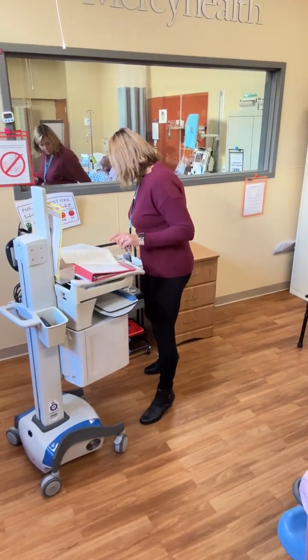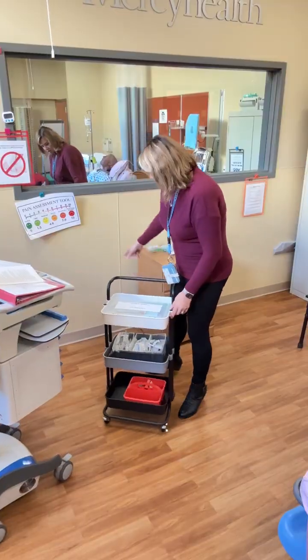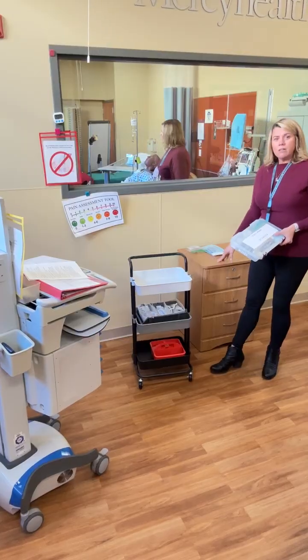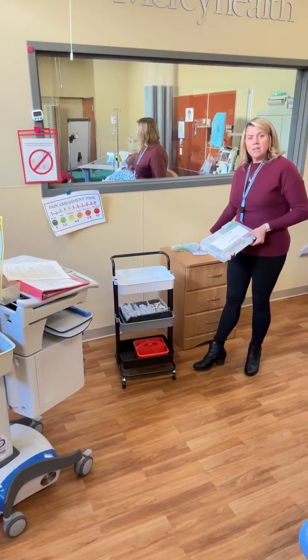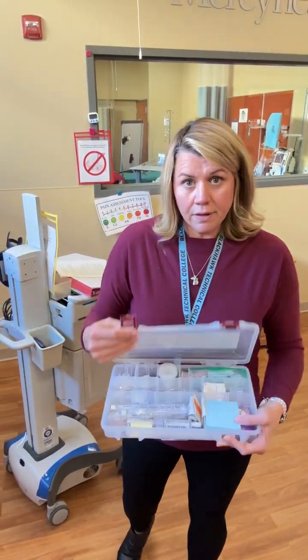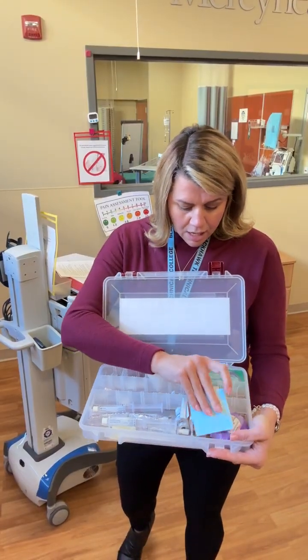Stan Mann has his med box right here. It's in this little location. It's always right here. Because he has IV fluids, we put the dresser over here too, so there's extra fluids and tubing set up right here for you. But here is his med box, and so everything that you're going to need is in here.